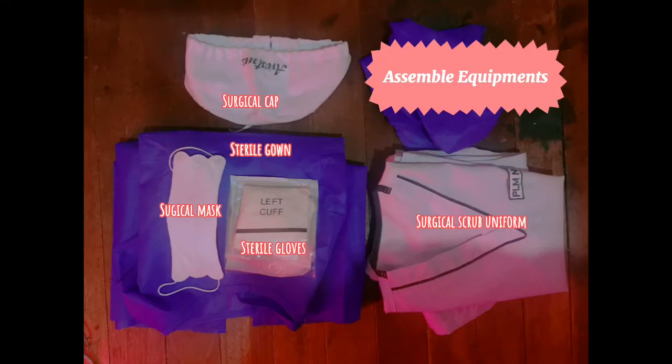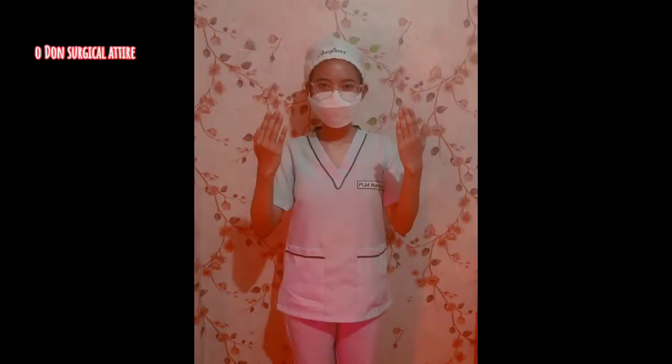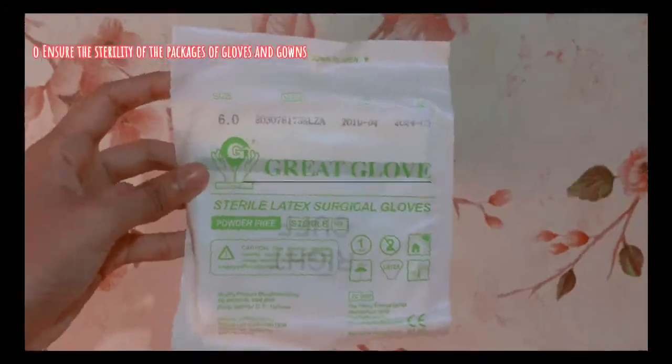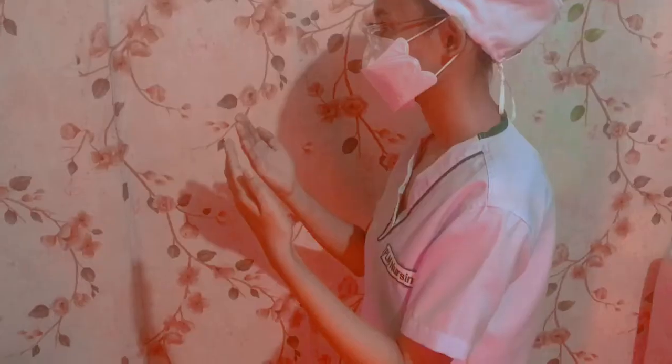Preparing the equipment beforehand makes it organized, saves time, and allows the procedure to run smoothly. Surgical attire prevents the healthcare workers from any contact with microorganisms. Hand hygiene reduces the transmission of microorganisms. Checking the expiration date and condition of the sterile gloves guarantees the sterility of the procedure.